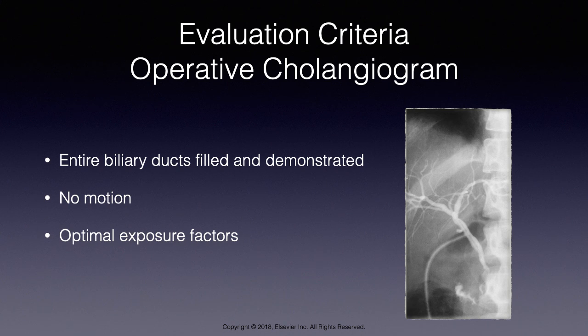Evaluation criteria for an operative cholangiogram. Entire biliary ducts filled and demonstrated, no motion, optimal exposure factors included.